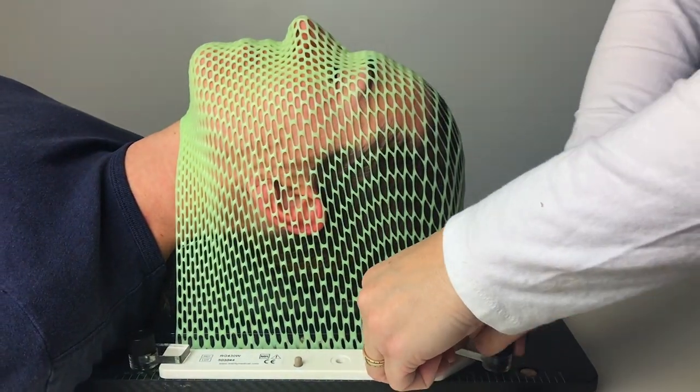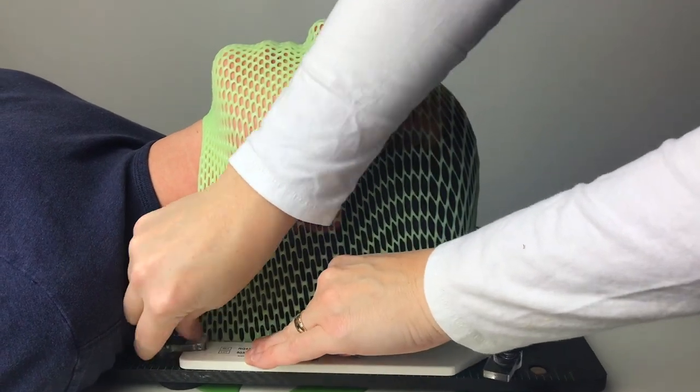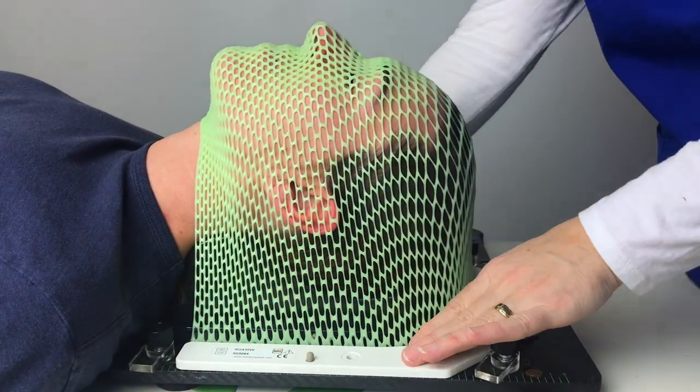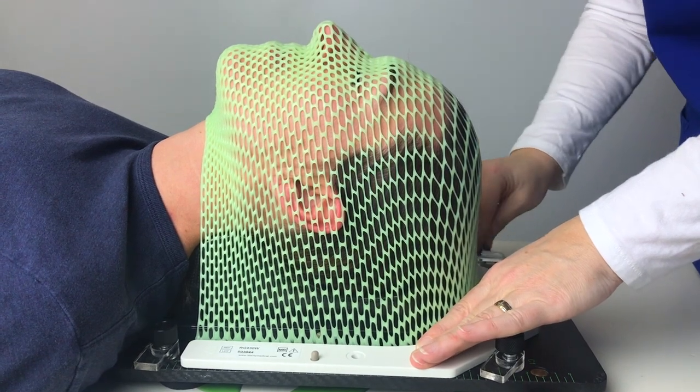Once the mask is cured, you can remove it from the base plate by loosening all four clips, and then pull up off the patient.